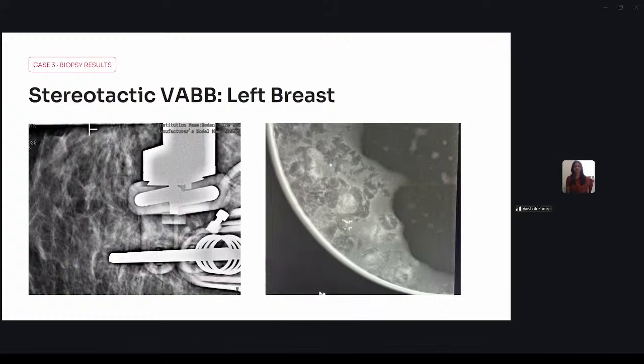Dr. Prekshi? Can I just add something? Yes. So specimen mammography is one thing, but I also feel that a detailed histopathological report is a must. Whatever lesion we say, we have to quantify, especially in VAB. For mammography detected things, if we are seeing calcification or not, because some calcifications are also different types.